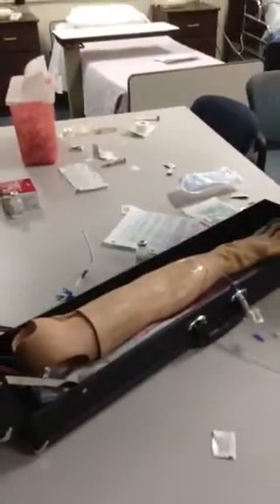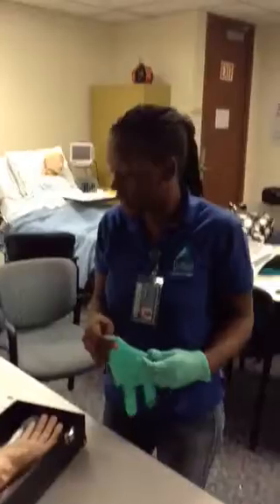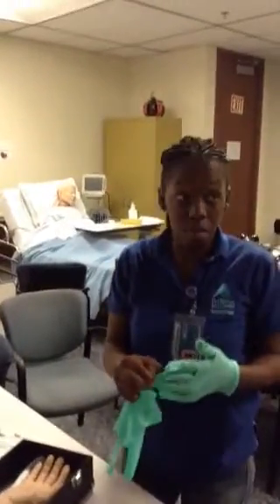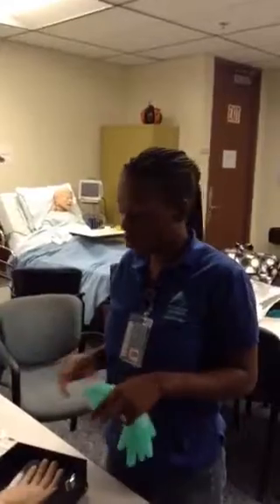I'm going to assess my site again — no pain, no inflammation, no redness. Then I'm going to document on my MAR: time, drug, dose, the rate I had my piggyback, the condition of the site, the volume of the med that was delivered, and any I's and O's. I'm going to clean up my stuff, dispose of all syringes, and that's it.